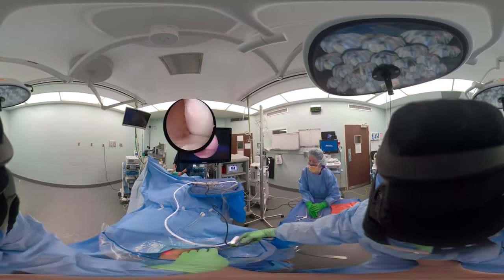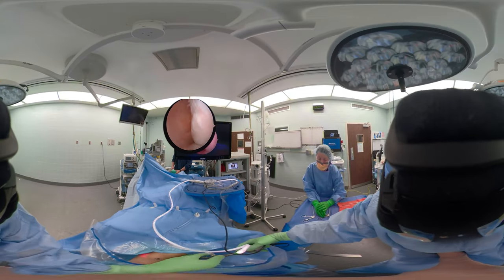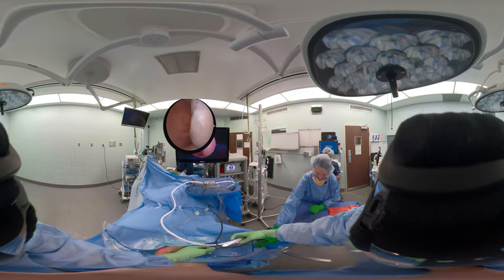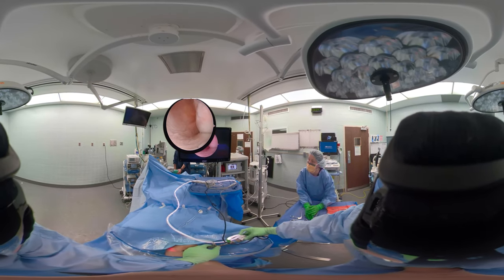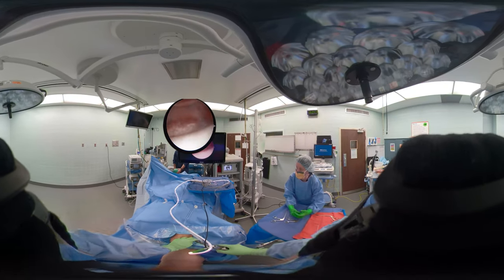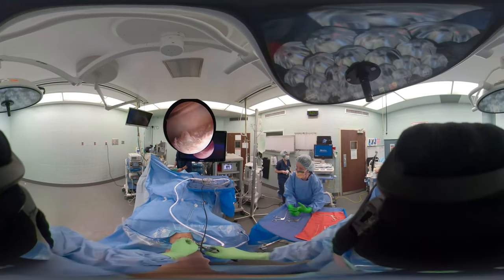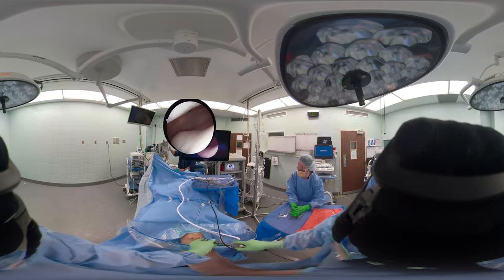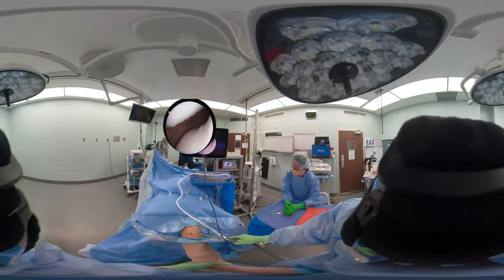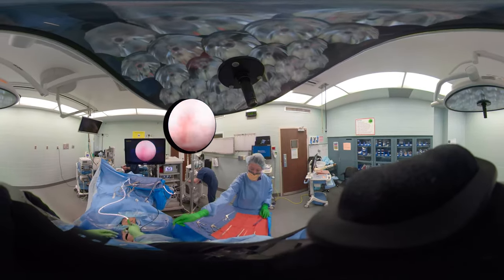This is a plica — a plical fold. The medial meniscus is down there at the bottom as you can see in the arthroscopic view. You can flush the knee out if there's fluid or hemarthrosis. Sometimes you have to flush it by leaving the cannula in, removing the scope, and letting gravity help you clear the knee. There's a little bubble there on the trochlear groove.